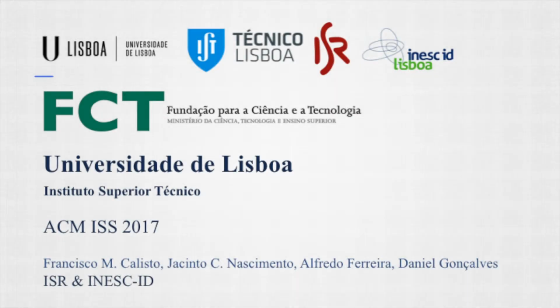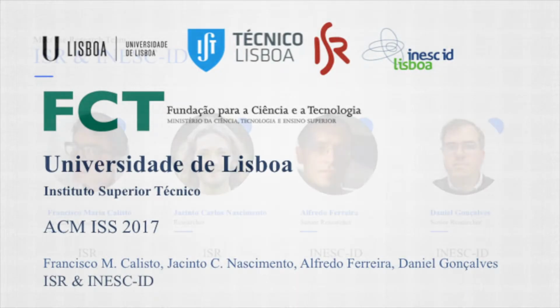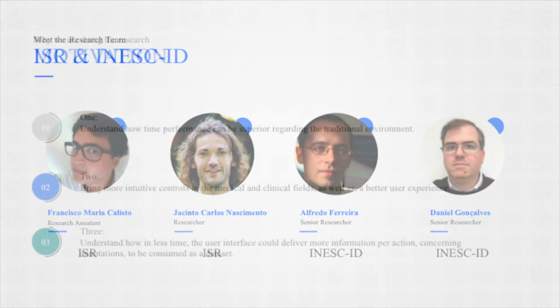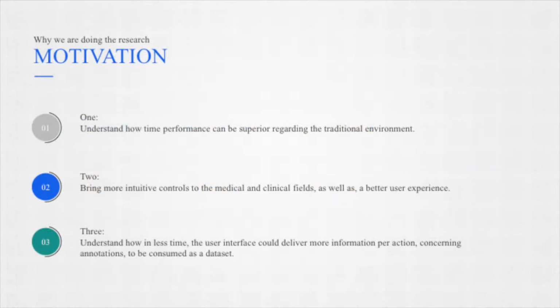A fundamental step in medical diagnosis for patient follow-up relies on the ability of radiologists to perform reliable diagnosis from acquired images. We present a performance and experience analysis, conducting a study of touch and traditional environments. The advantages of touch are threefold and motivated us.